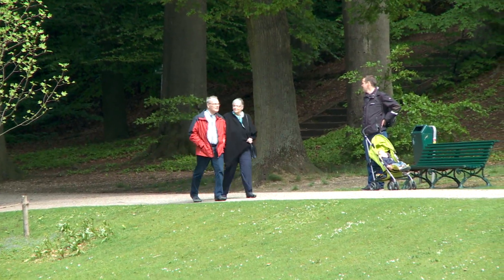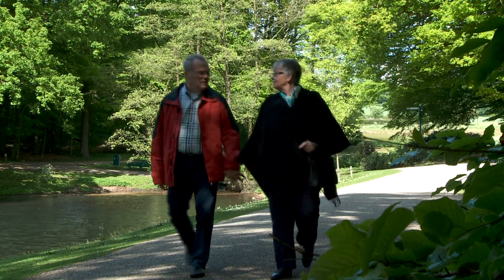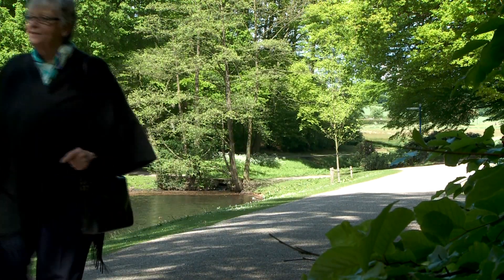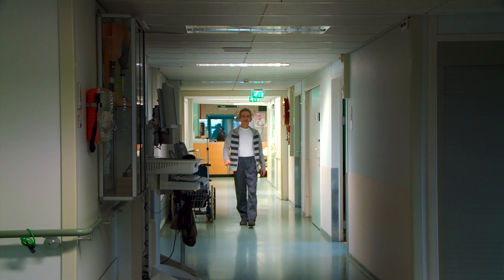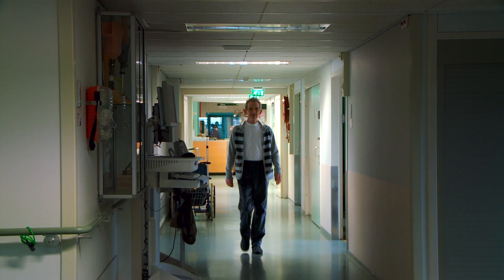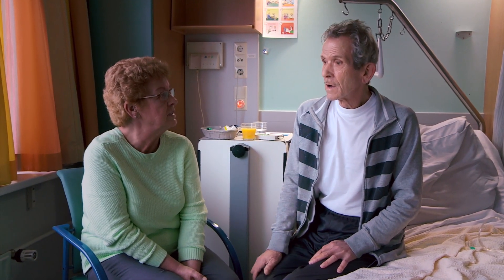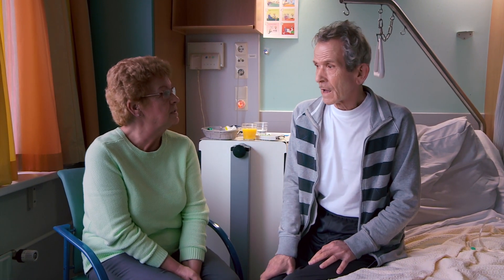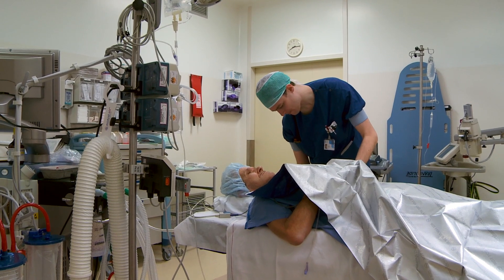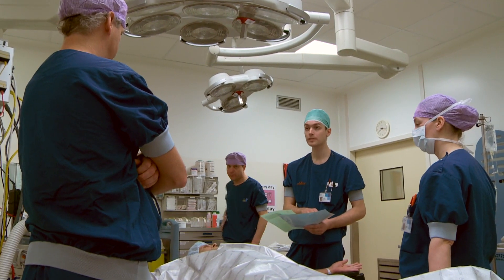When these walking exercises do not lead to results and the patient keeps having disabling claudication, an operation may be considered. Today we are treating a 70-year-old male who has been suffering from disabling claudication for some time. Despite the exercises, his walking distance is shortened to only 50 meters, and he also suffers from rest pain.